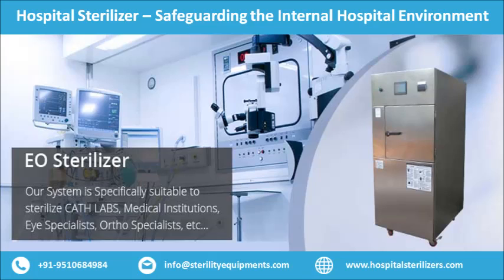EO and ETO sterilizers stand for ethylene oxide, which is a gaseous compound known to possess sterilizing potential at a very low temperature. High temperature is a natural sterilizer as most microbes cannot withstand high temperature, hence they die, but at low temperatures, there is a need for an external sterilizing agent. Ethylene oxide is a colorless and poisonous gas that attacks the cellular protein and nucleic acid of microorganisms.